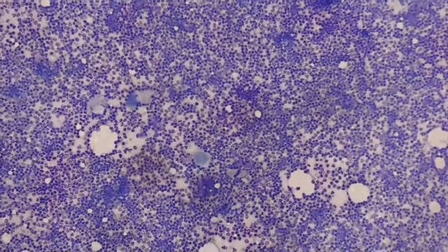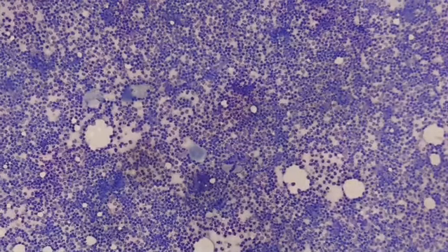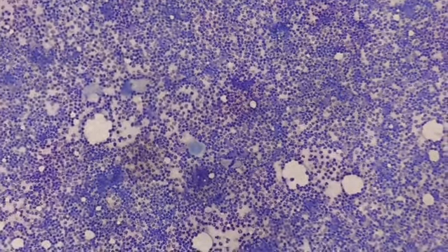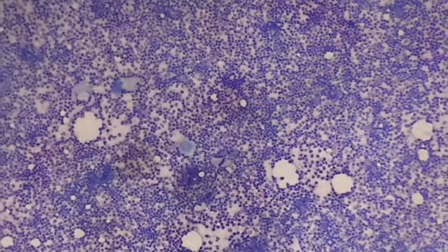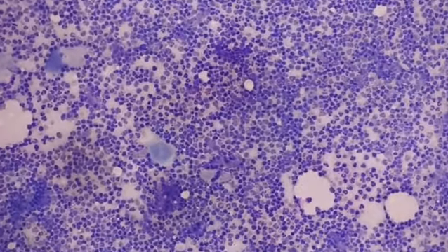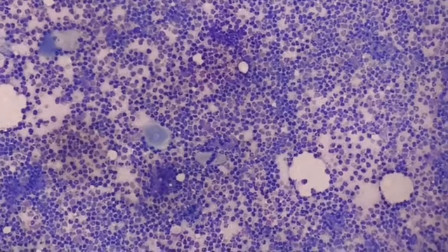So when we make a diagnosis of subareolar breast abscess, we need to have mainly three, four components. You need to find anucleated squames in the smear, then you need to have keratin debris, and then cholesterol crystals, foamy histiocytes, and sometimes all these bluish areas which are showing are your anucleated squames.